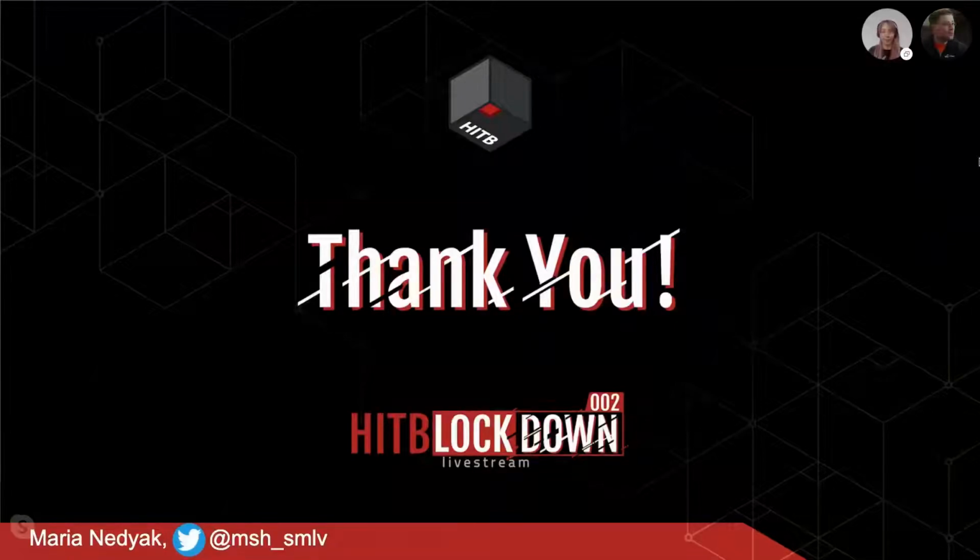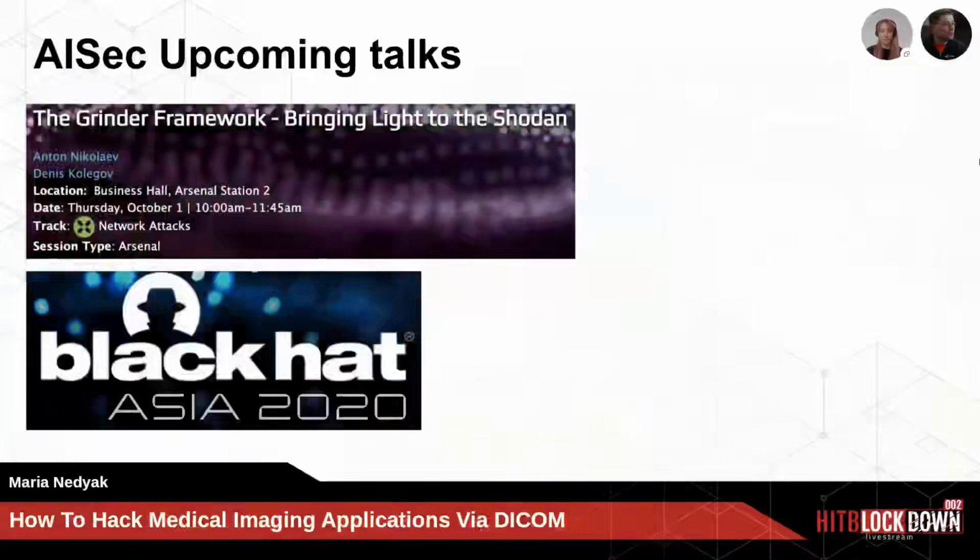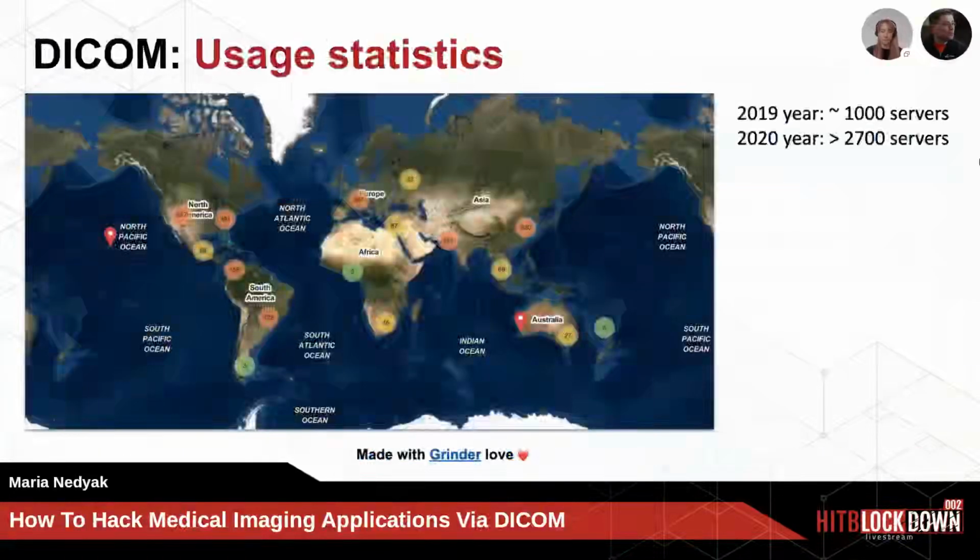Okay, fair enough. One question that I just had was, you showed that the amount of DICOM servers had gone up to over 2,700, but those are all accessible on the internet. Yes, this framework uses a Shodan database for scanning, and it takes all the DICOM servers from the Shodan database and rescans these services.